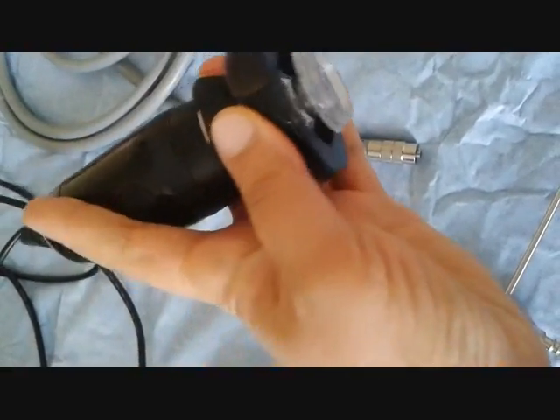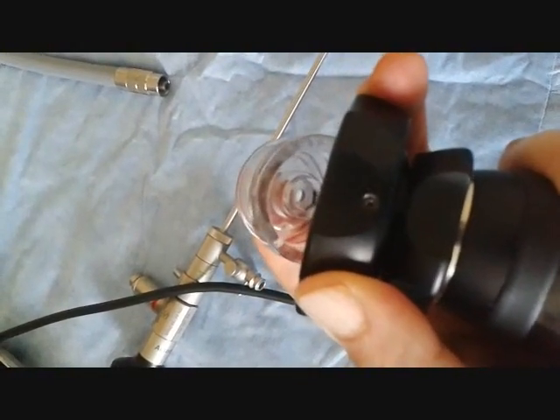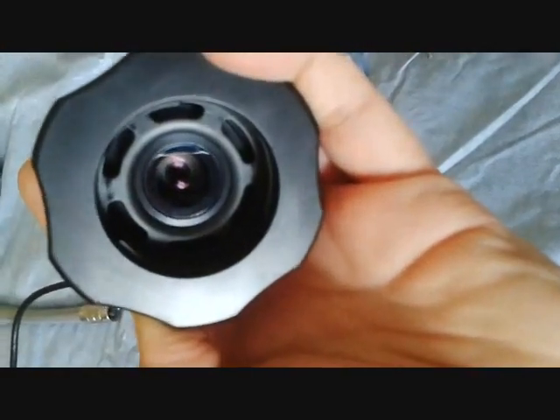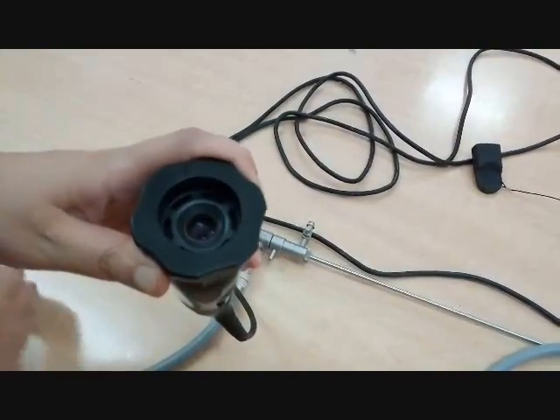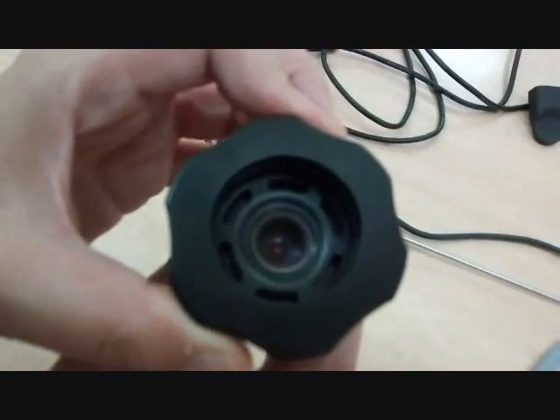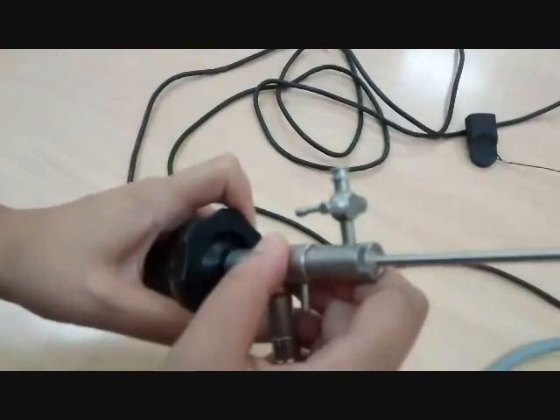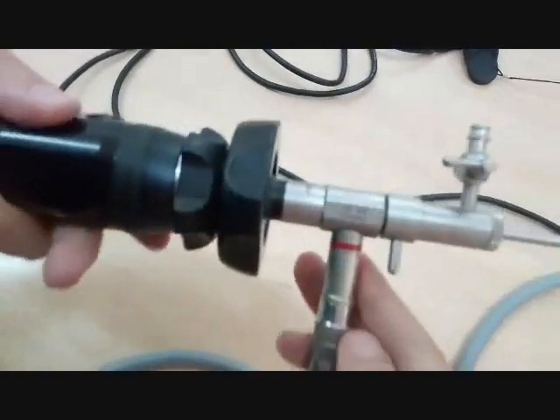First, look at the camera. We can rotate the big ring here, and the protector is out. Look at these protrusions here. We rotate the ring, they get in. See? Like that. We rotate the ring in the opposite direction, and they're out. And again, look at the way we rotate the ring. Look at the reliefs, they're out here. We rotate the ring, and they're in. Again, they're out. You see? So, we rotate the big ring again. The reliefs are in. We put the scope. We lock. You see? It's very simple.